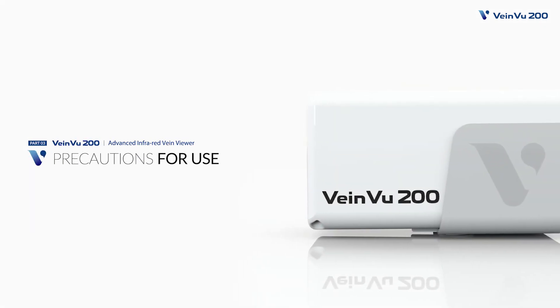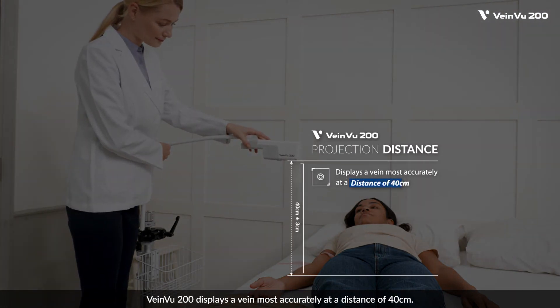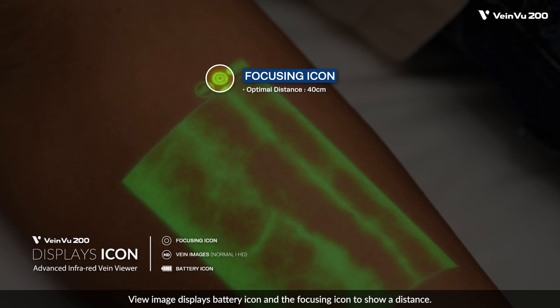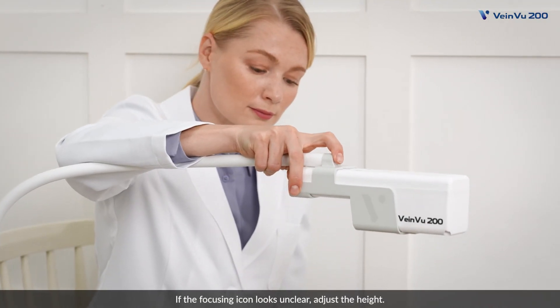Precautions for use. VainView 200 displays a vein most accurately at a distance of 40 centimeters. The view image displays a battery icon and a focusing icon to show the distance. The focusing icon appears clearly at a distance of 40 centimeters. If the focusing icon looks unclear, adjust the height.